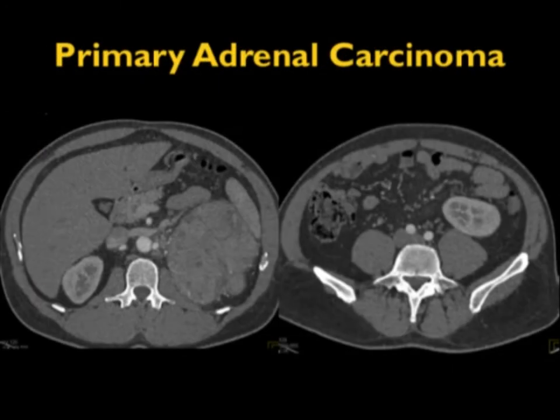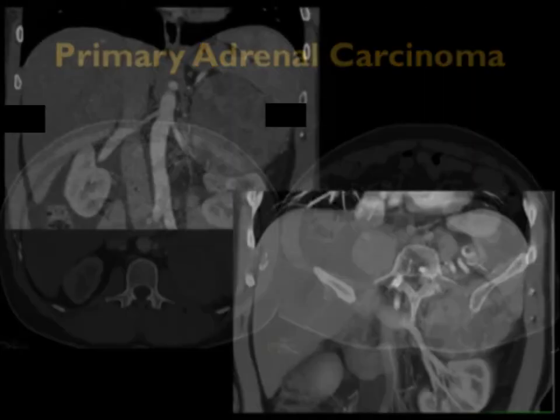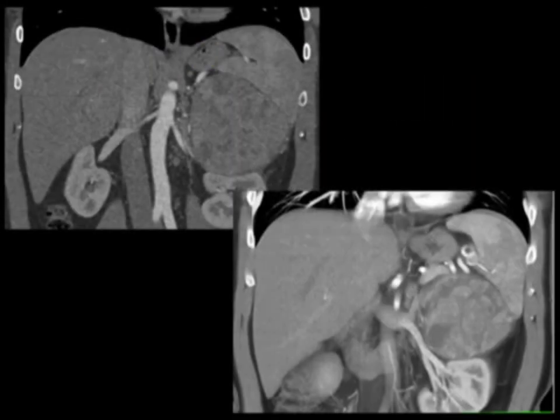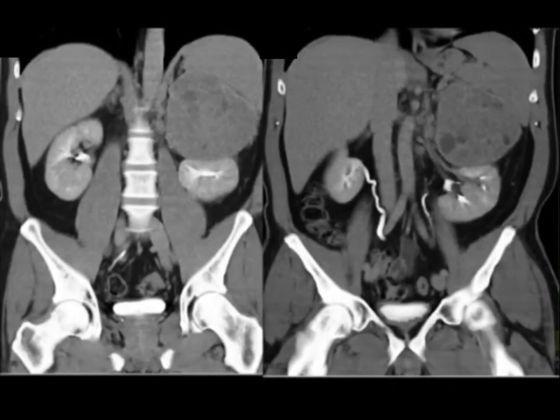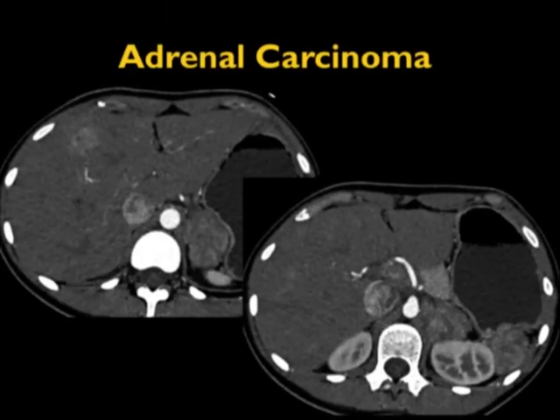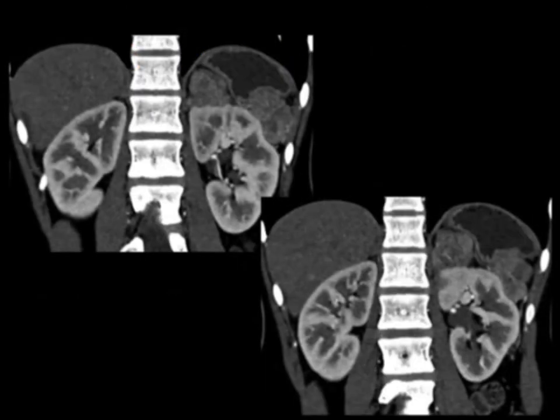Here's a nice example — classic left adrenal mass, pushes on the patient's left kidney, solid with minimal enhancement. This was a primary adrenal carcinoma. Very nice vasculature on both the arterial and venous sides, which were invaded. You can see the extent of that tumor and its orientation. Here's a case of a left adrenal mass with metastasis to the adrenal, seen very nicely on the coronal view — a normal right adrenal but a mass in the patient's left adrenal.